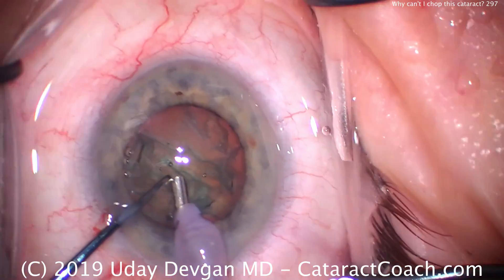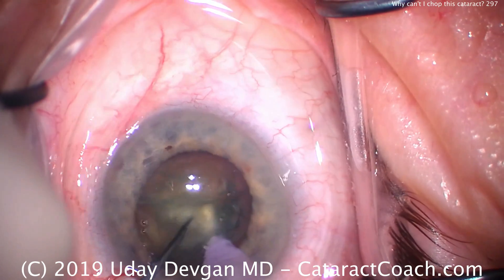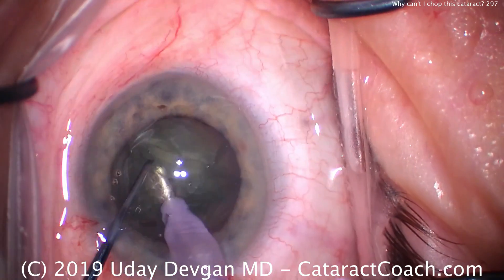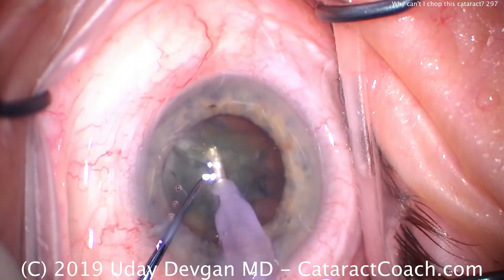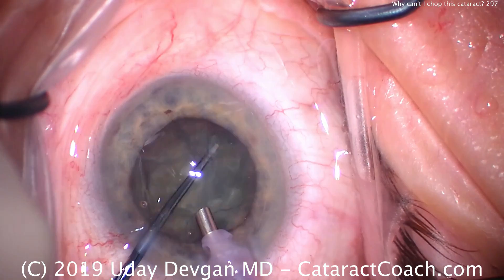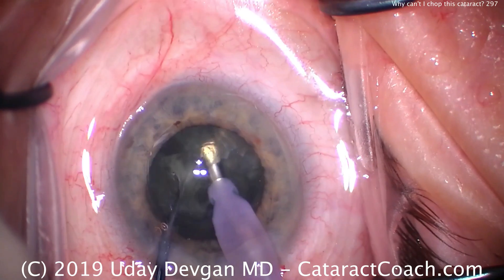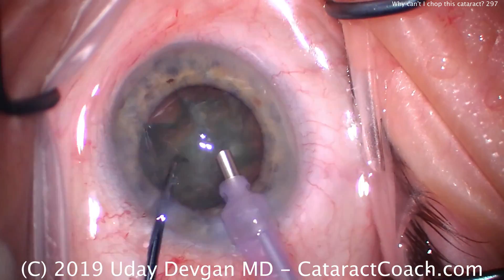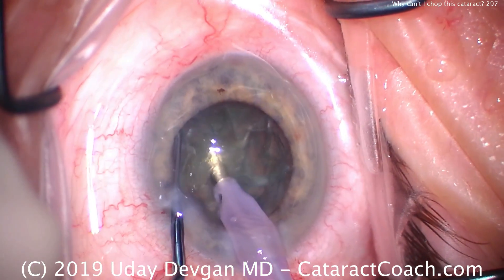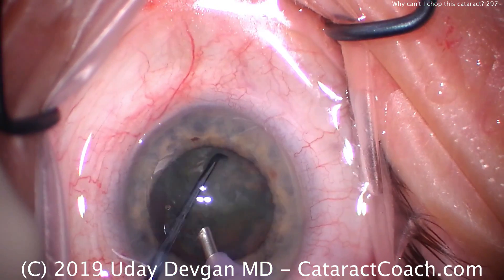Here's the faco probe going in there, there's the chopper. We buzz in with the probe, place our chopper and no chop. Try again, buzz in and just not getting any chop out of this thing. It doesn't seem that dense. Let's try a horizontal move here — maybe a little better. Rotate the nucleus, buzz in with the faco probe, there's the chopper. A little bit of a chop, not much. Rotate again, buzz in, get the chopper around there and still just ineffective at chopping.